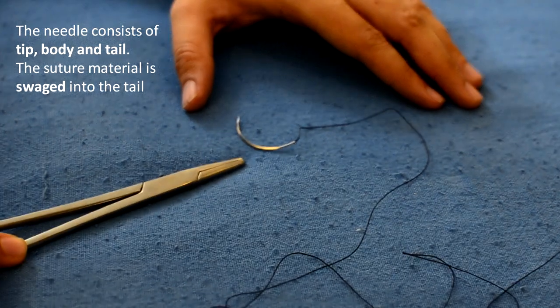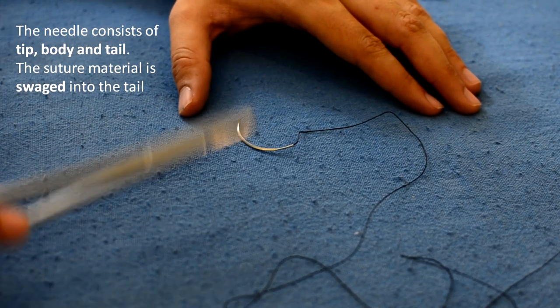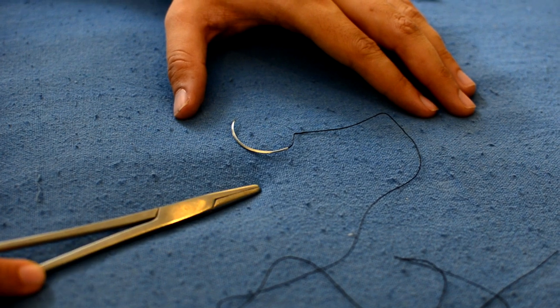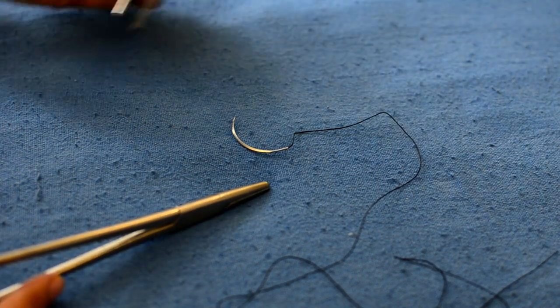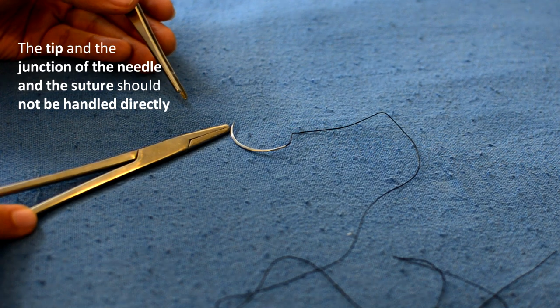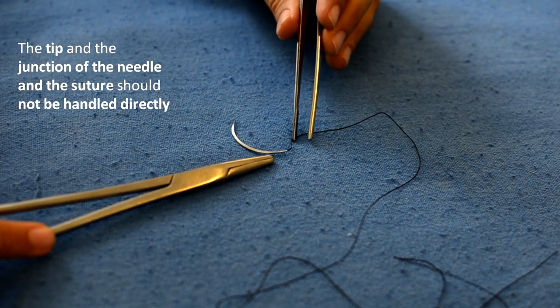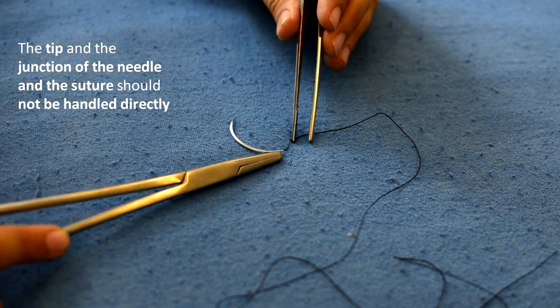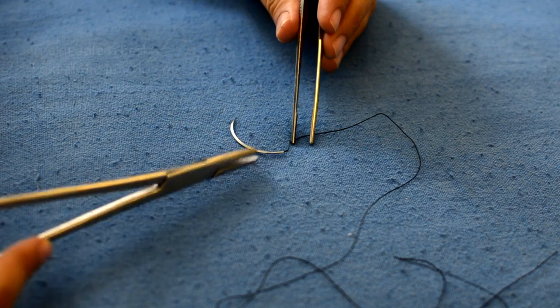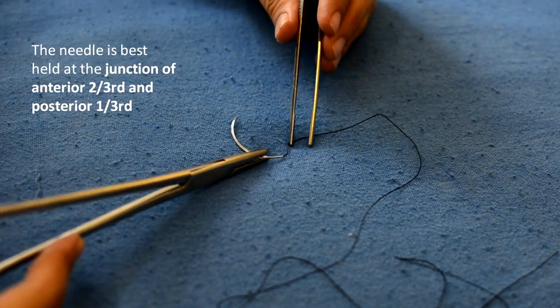Here we see the basic parts of the needle. There's the tip, the body and the tail. The thing that we have to remember is that the tip and the junction of the needle to the suture should not be handled directly. It's best to hold the needle at the junction of anterior 2-3rd and the posterior 1-3rd.